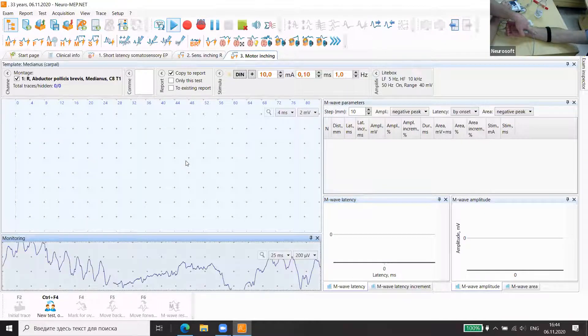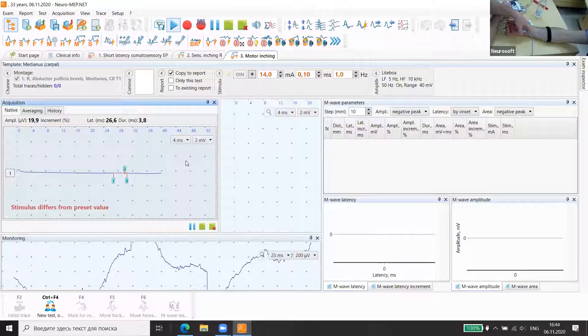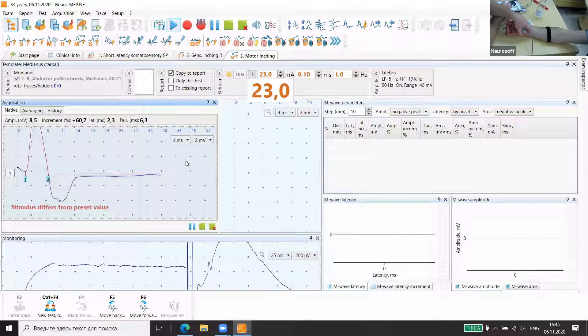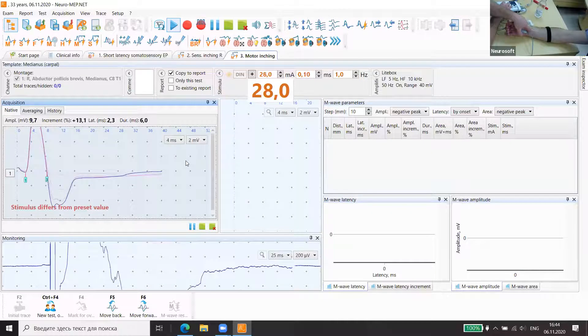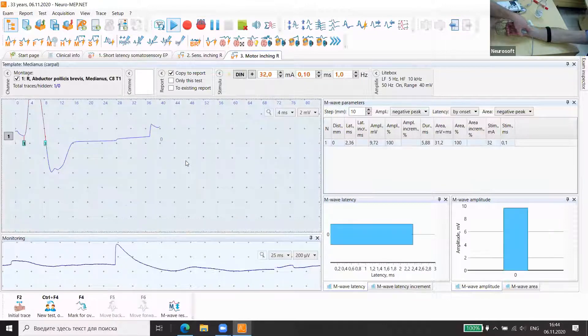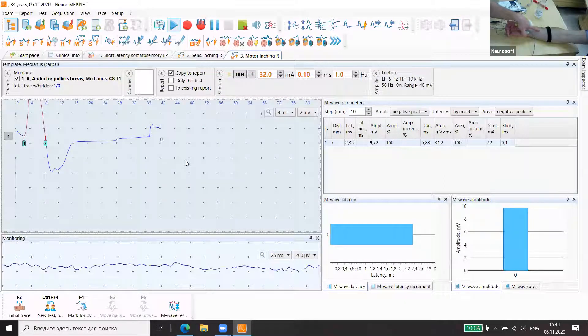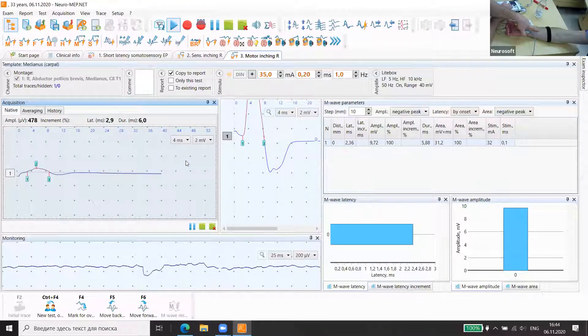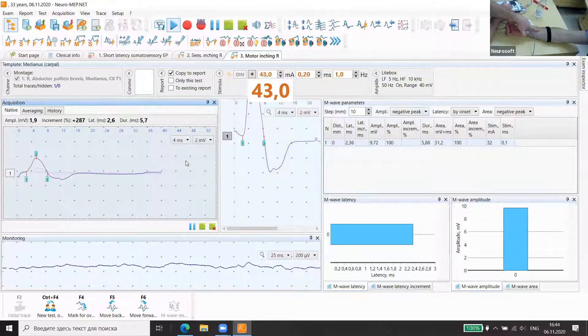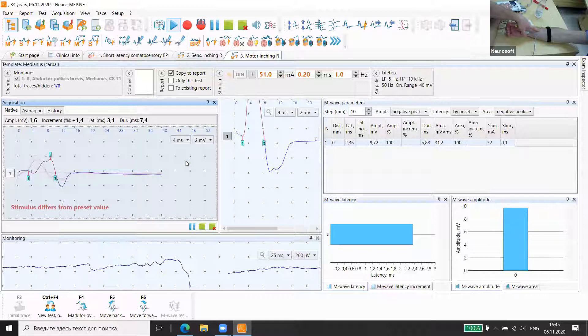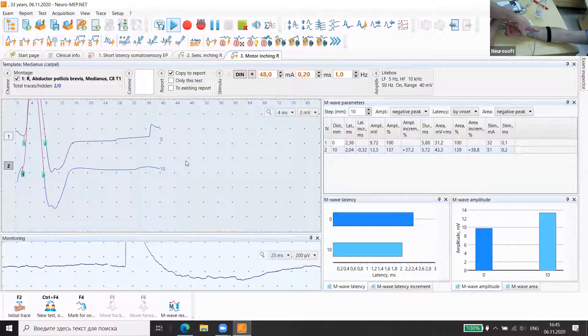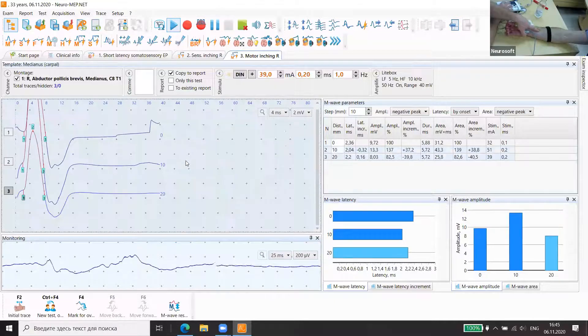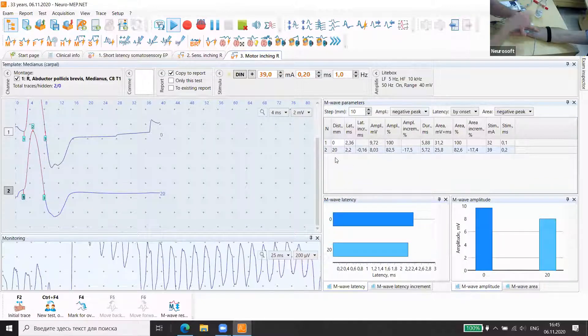Again, stimulate with different level of stimulation, supramaximal level. Usually we already developed this after conduction velocity. We know the supramaximal level. Change position to the next point. This place the nerve is much deeper. Yes, it's very deep. Now it's okay. It was not enough, additional answer. Delete trace. Go further.